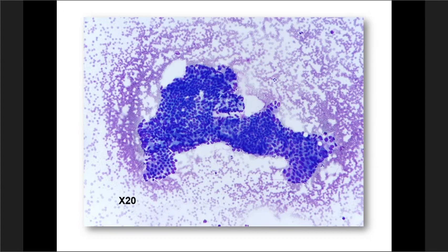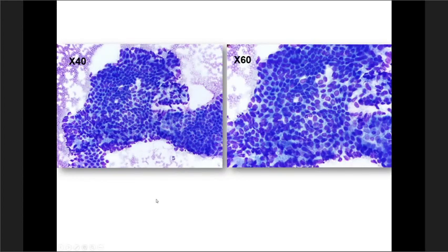slightly higher magnification. And here the anisonucleosis becomes a little bit more apparent. Take a look at this nucleus, for instance, here. This is the same group. Come to this side, take a look at this nucleus here. Significant size variation, I would say a good 1:4 ratio, but this is a Diff-Quik stain slide. I would say this is an adequate specimen at the time of adequacy, but for diagnosis, I would still wait for looking at it at a higher magnification.